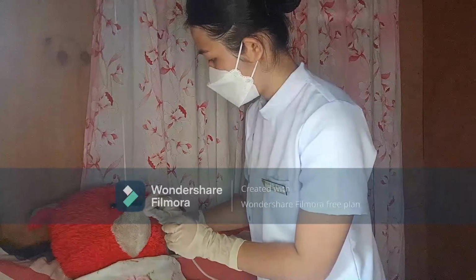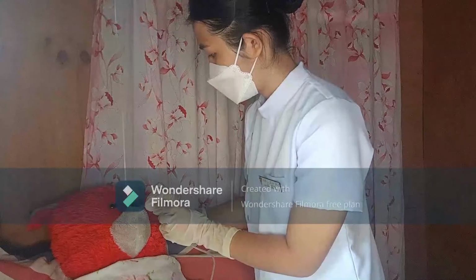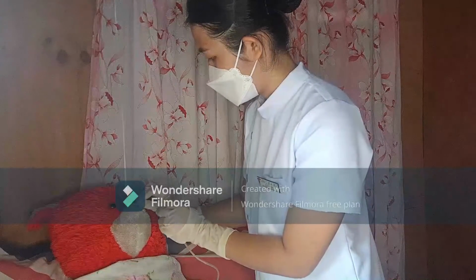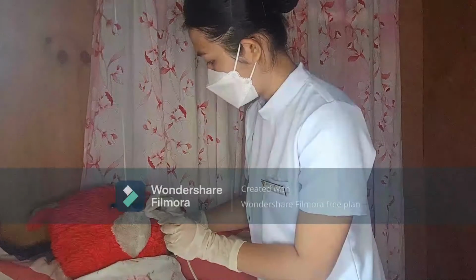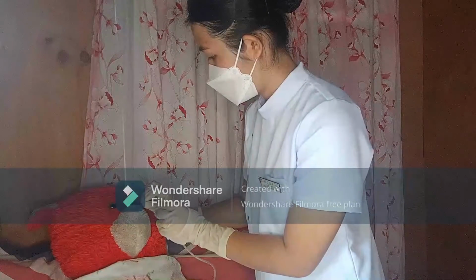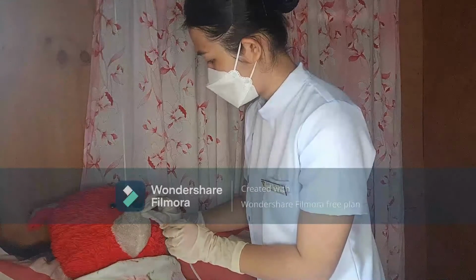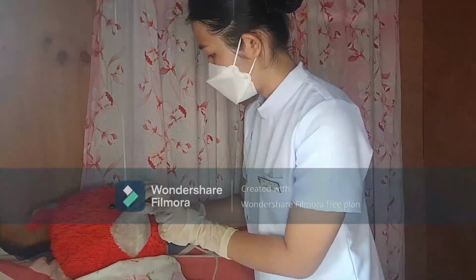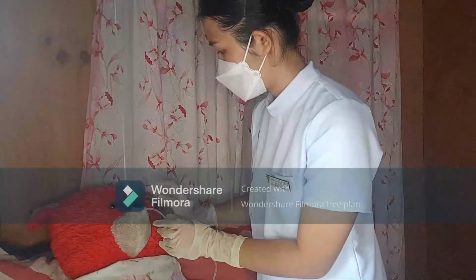Then, slight pressure and twisting motion are sometimes required to pass the tube into the nasopharynx, and some clients' eyes may water at this point. If tube meets resistance, withdraw it, re-lubricate it, and insert it in the other nostril. Once the tube reaches the oropharynx or the throat, the client will feel the tube in the throat and may gag and retch. Ask the client to tilt the head forward and encourage the client to drink and swallow.